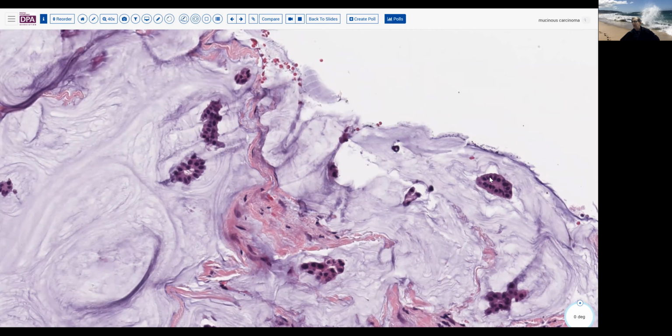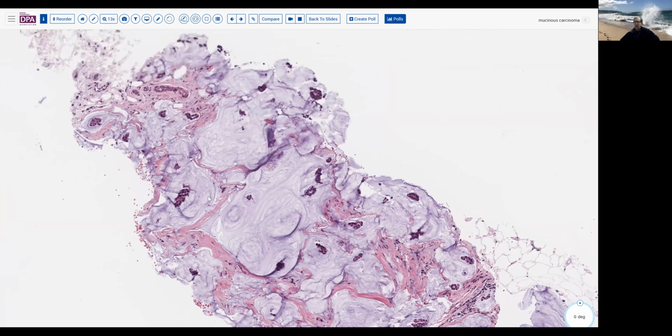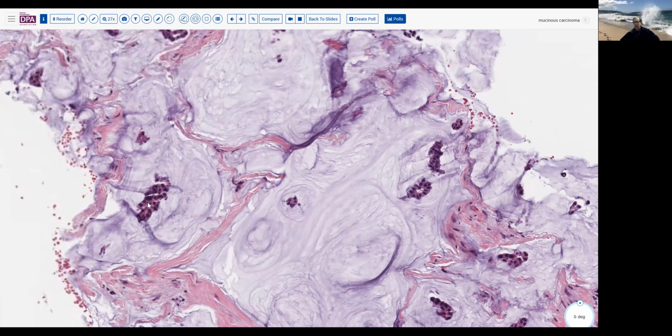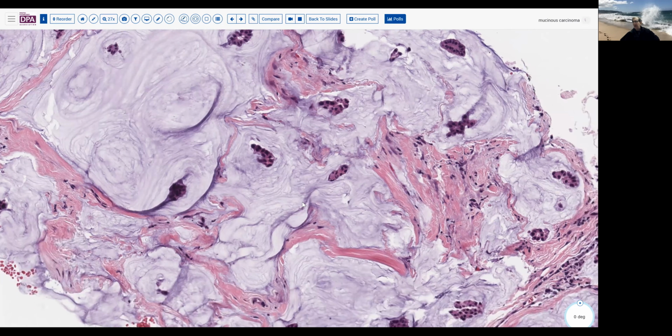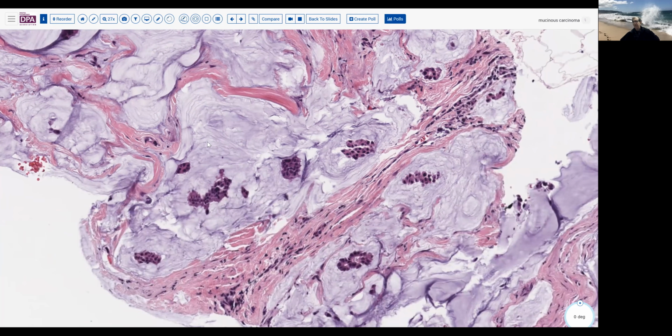They don't tend to have a lot of intracytoplasmic mucin and so forth. Grading for this tumor is generally not included in the Nottingham scoring system, but you certainly are welcome to provide a nuclear grade, which should be low, 1 or 2. And by virtue of the fact that the cellularity is going to be extraordinarily low, it's undoubtedly going to be a low mitotic score. And so you're going to be left with a low-grade tumor.